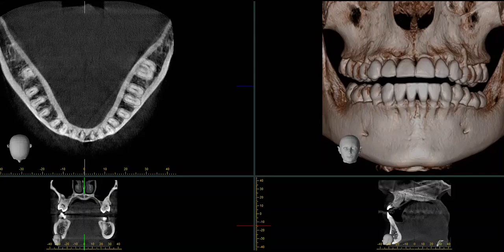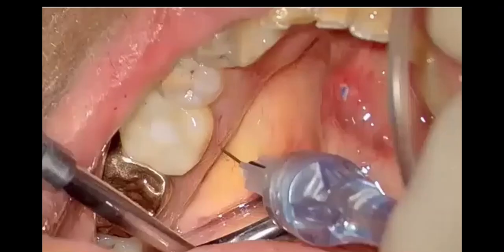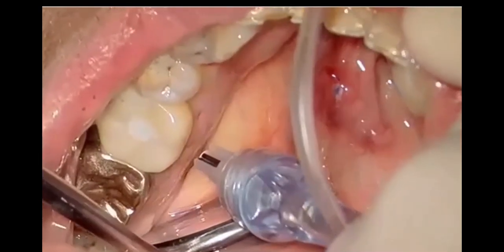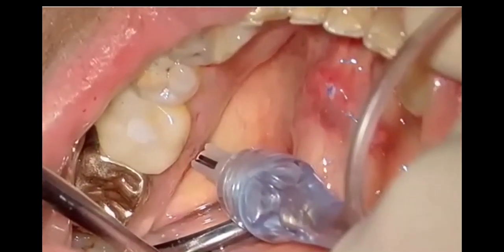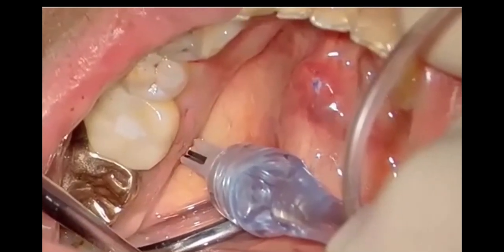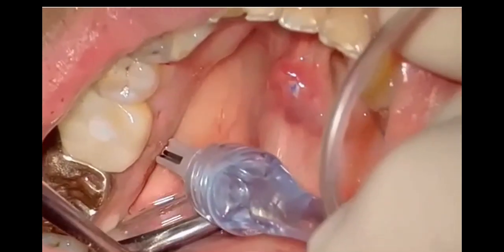As a result, all first molars will receive half a carpule of septicaine on the buccal and half on the lingual, and the lower second molars will receive 3/4 of a cartridge of septicaine on the lingual. This is a mandibular lingual infiltration for tooth number 19, which is done by slowly injecting a half a carpule of septicaine at the level of the apex on the buccal and half a carpule of septicaine on the lingual.